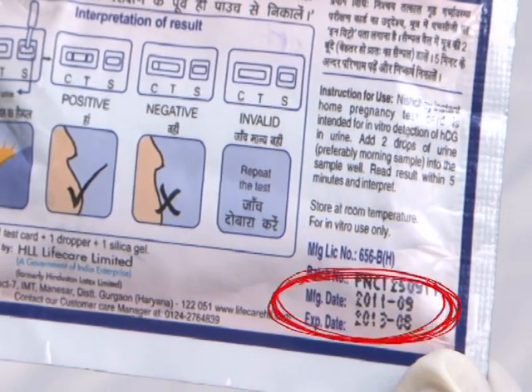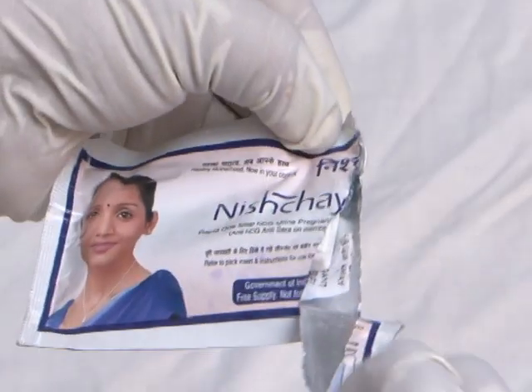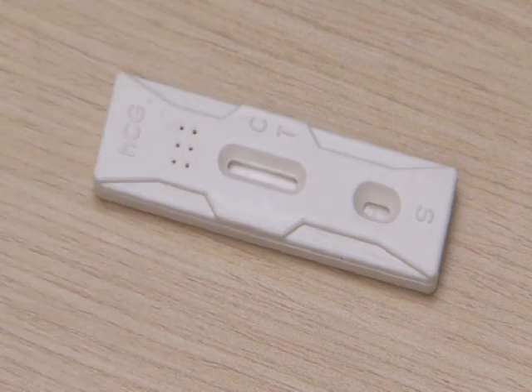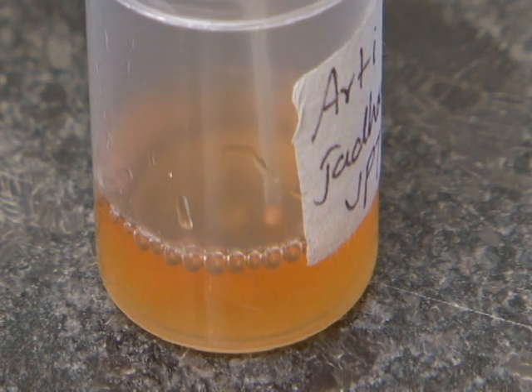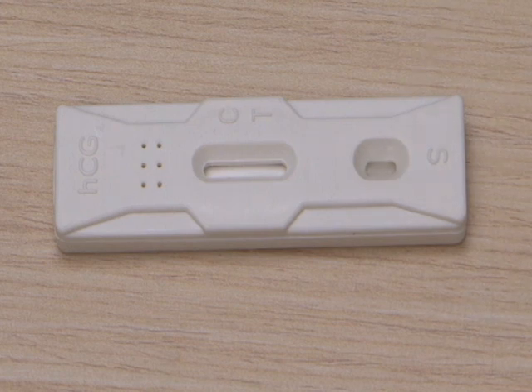Procedure. Check expiry date on the kit. Open the kit from one side. Remove the pregnancy test card from the pregnancy kit. Keep this card on a flat surface. Use the dropper provided in the kit to take urine from the container. Put 2 drops in the well marked S.